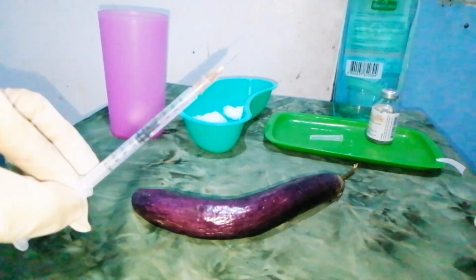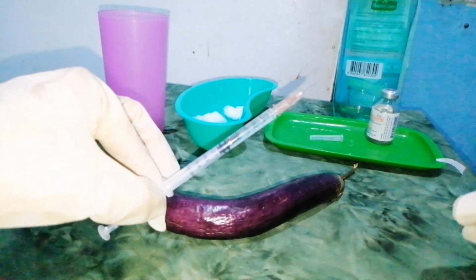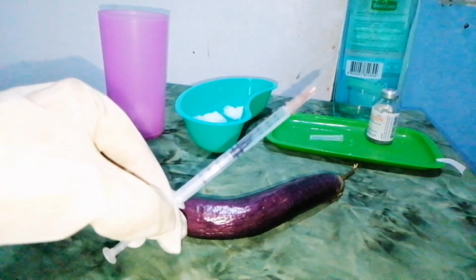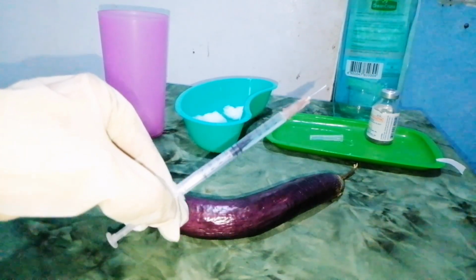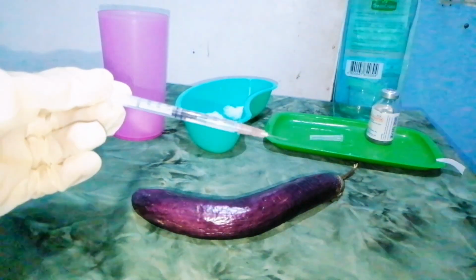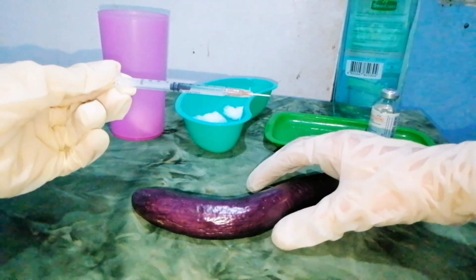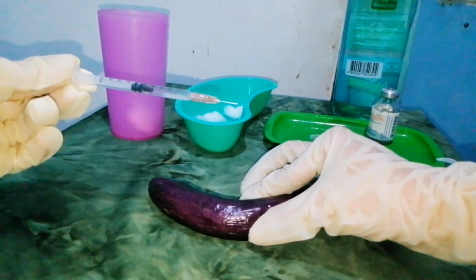Expel any air bubbles from the syringe; small bubbles that adhere to the plunger are of no consequence. And grasp the syringe in your dominant hand close to the hub, holding it between the thumb and forefinger. Hold the needle almost parallel to the skin surface with the bevel of the needle up. And inject the fluids. With the non-dominant hand, pull the skin at the site until it is taut.